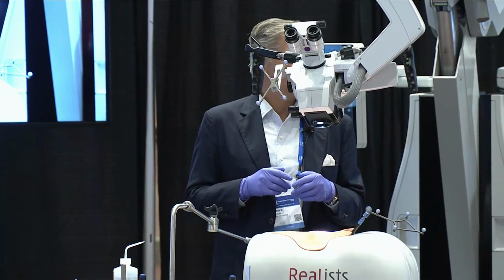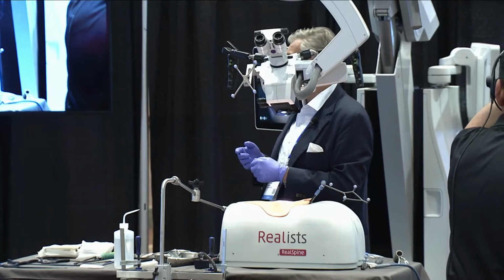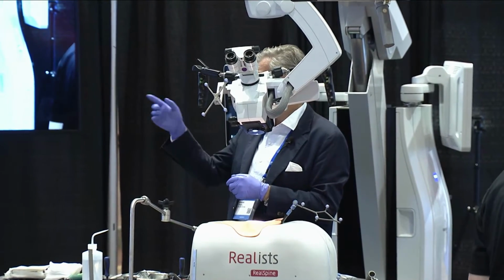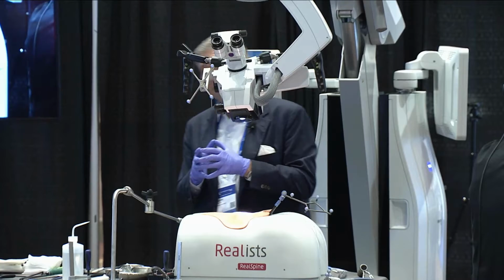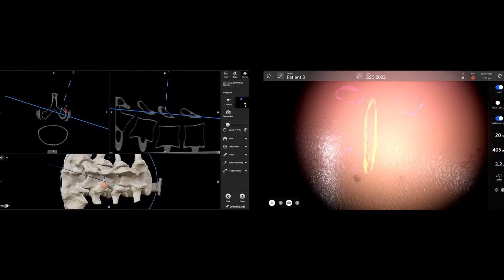So, I put the microscope in here now, and if you can see that on your screen, the view of the microscope, if we can select that so the audience can see that. Can we show the audience? Yeah, you can see now we're looking through the microscope on the skin.